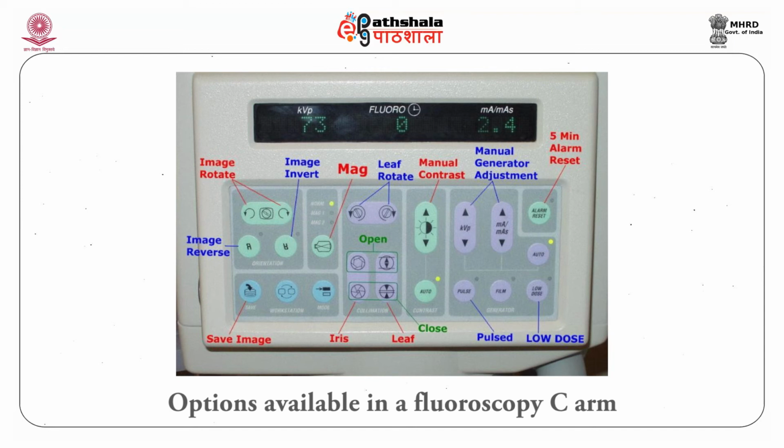Some of the safety checklists in fluoroscopy are to obtain patient history about previous radiation exposure, ensure operators and personnel wear well fitted lead aprons, thyroid shields and protective eyewear, and position hanging table shields and overhead shields prior to the procedure. In some cases, use ultrasound imaging when possible. Position the detector, which is the II, as close to the patient as possible. For C-arm type fluoroscopic units, maximize the distance from the radiation source.